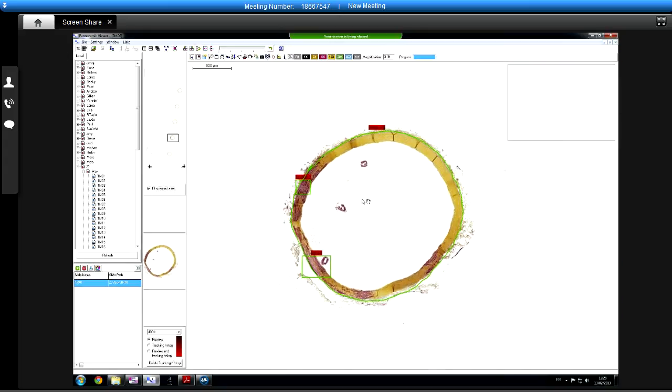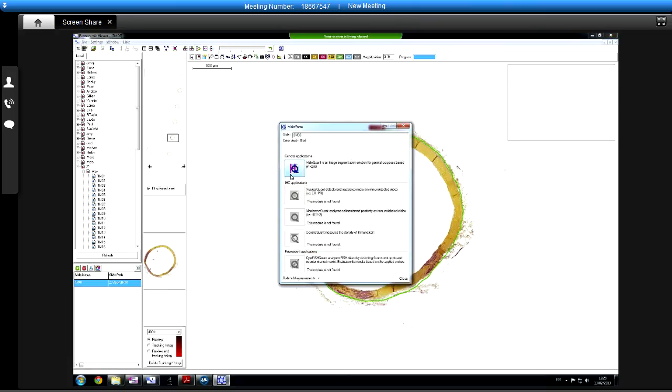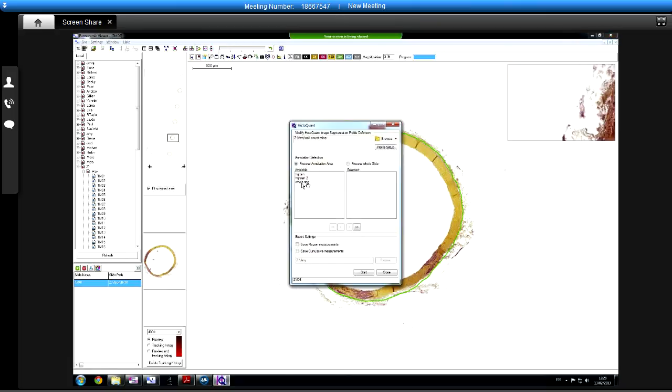There isn't a way to delete something from a scanned image, is there? No, you can export annotations back to the original slide format, so you can take out a subset of the data, and that's effectively like deleting. I was just thinking about deleting those three little blobs in the middle. Not now, but if I was doing it myself, you know the way you draw a mound? I guess I could go in and go around like that.